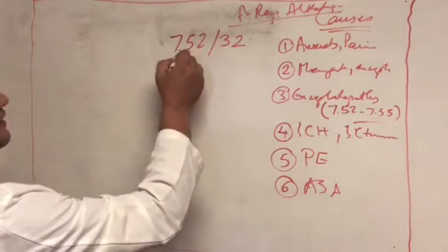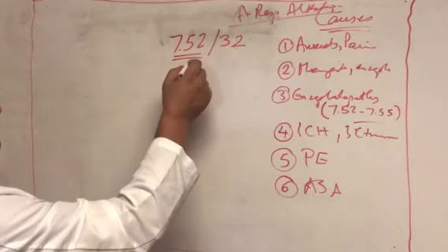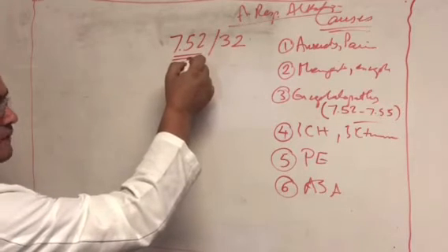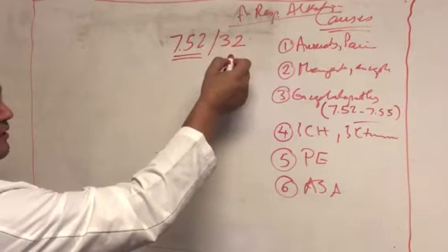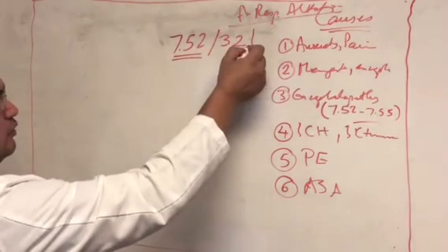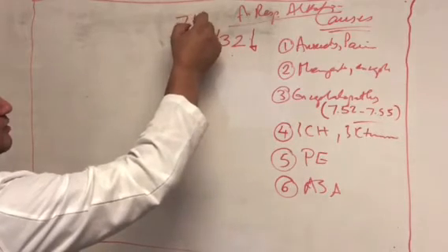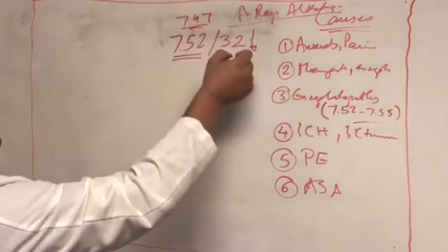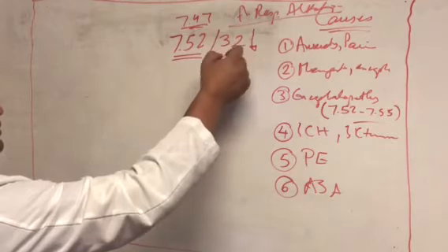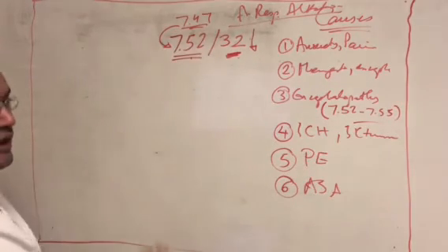So basically, this one is what? We'll take it the same way we dissected the gas before. 7.52, that's alkalosis. Is it respiratory or metabolic? It's respiratory. Is it pure or mixed? This went down by 8. That will result in a change of 0.07. So the gas should have been 7.47 from the change of the PCO2 that happened. But in addition, there is something else, which is metabolic alkalosis.